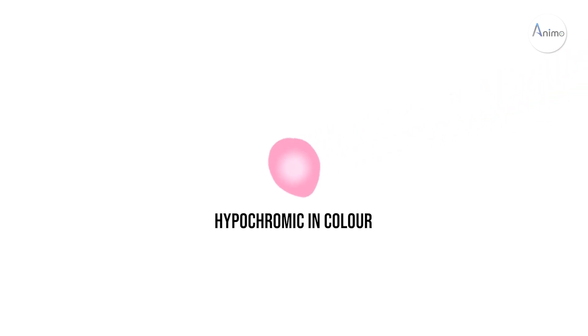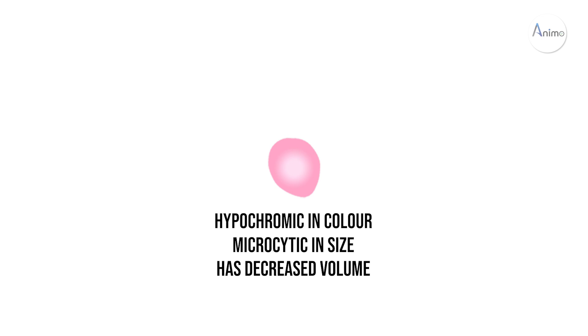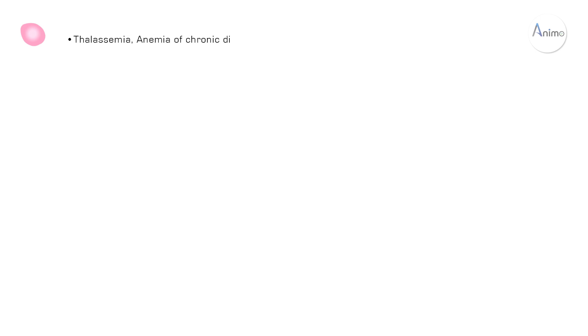This is a small RBC, hypochromic in color and microcytic in size. It has a decreased volume, so this is called hypochromic microcytic RBC. It is found in thalassemia, anemia of chronic disease, iron deficiency anemia, and lead poisoning. You can remember these diseases by the mnemonic TAIL.